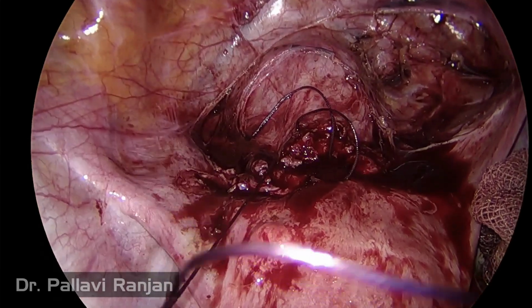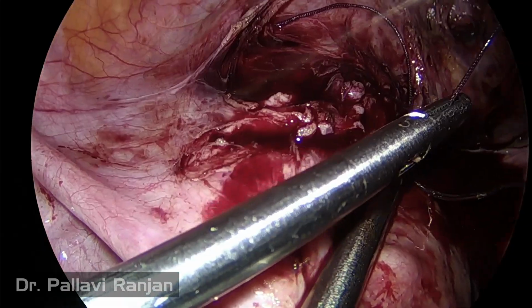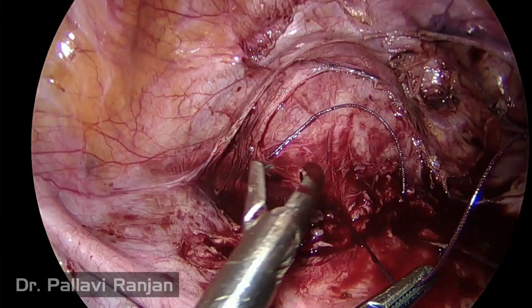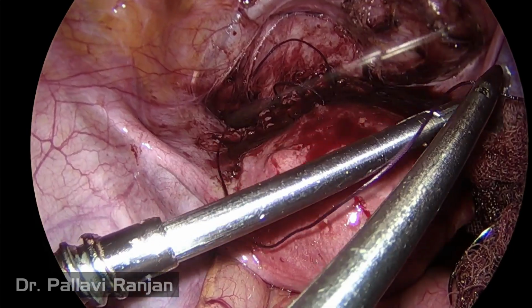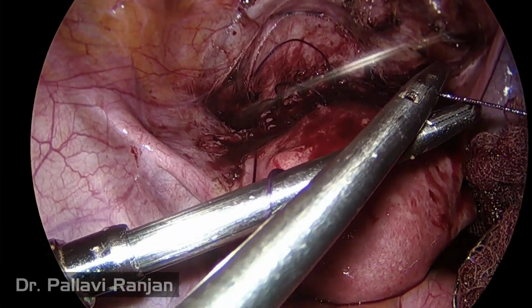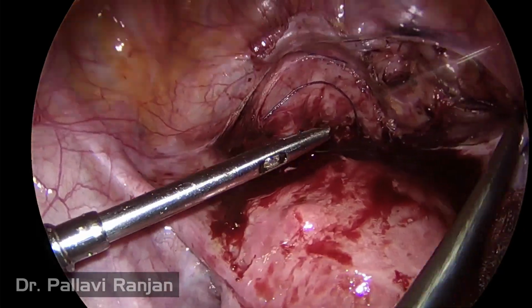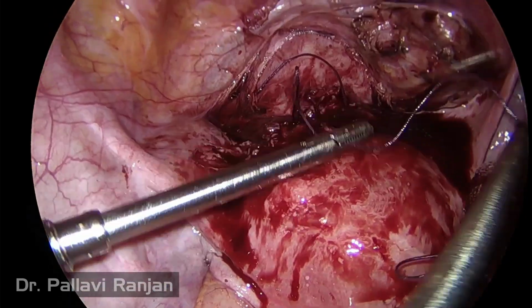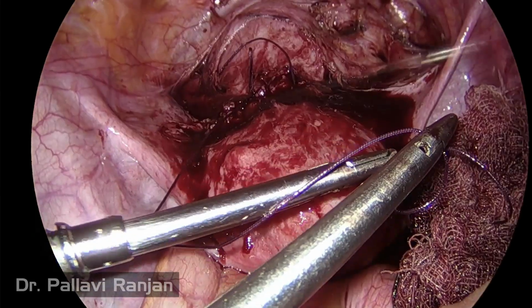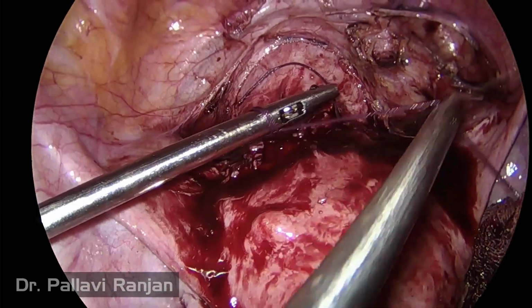So this is the first layer I am suturing, and I am taking full thickness bites from above and going down and taking full thickness bites from below. After that I will do a second layer of suturing as well. One has to ensure proper hemostasis during this time, because if proper hemostasis is not achieved, it might lead to post-operative bleeding, infection as well as pain.